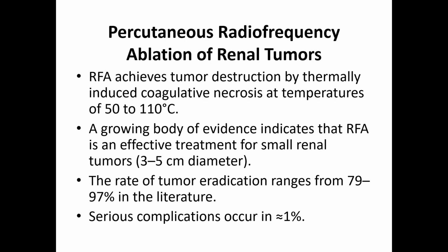Another title, which is not new for urologists but is new for us, is percutaneous radiofrequency ablation of renal tumors. When you do this ablation, you get access inside the kidney and put in a special needle.